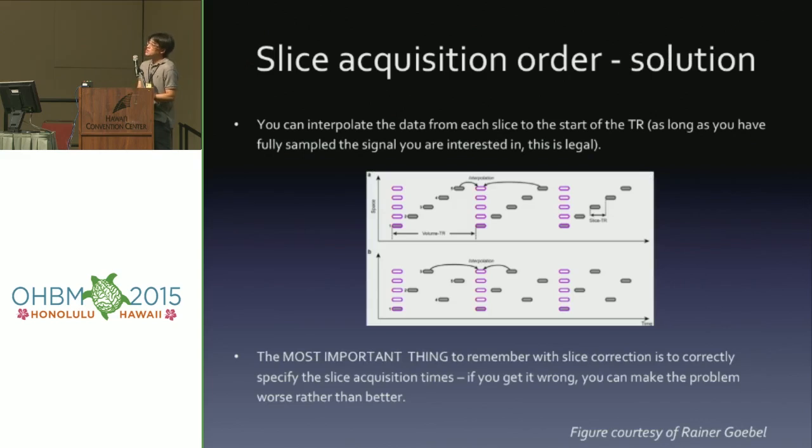Okay, so what's the way to correct this? The way to correct this is very simple. We use temporal interpolation. Here I'm giving you an example of linear temporal interpolation.